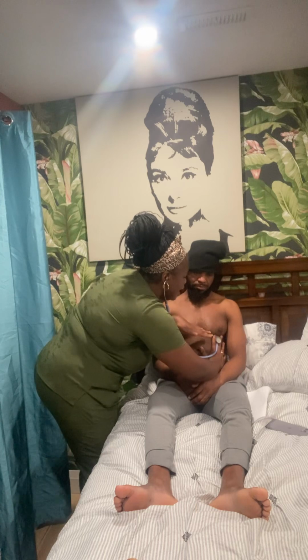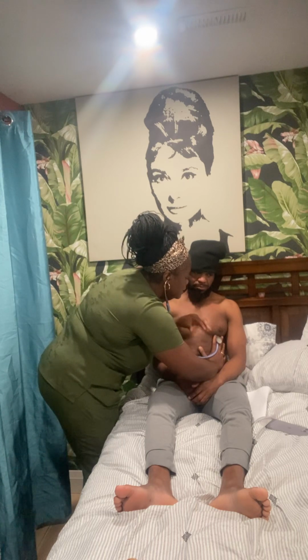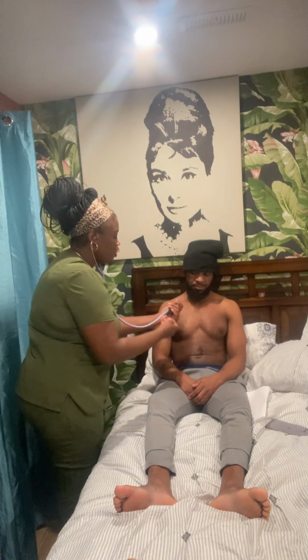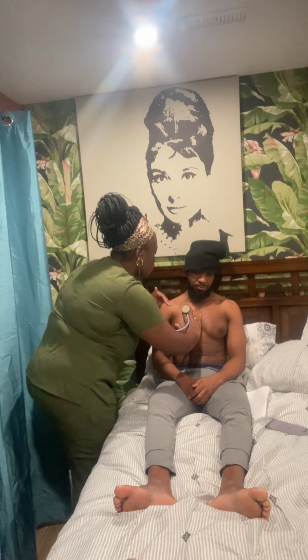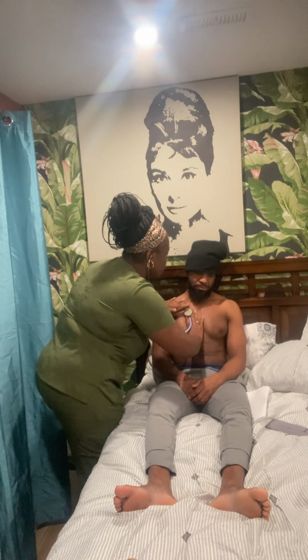Now at the mitral valve, I'm going to be auscultating for the apical pulse. This is where you get the most accurate reading for a patient that has any form of irregular heart rate or murmurs. That's where you would check for a full minute. Now I'm going to be turning over the diaphragm. Now I'm going to be listening for murmurs. Now murmurs sound like a whooshing or swooshing sound. So we're going to go again, second intercostal space. So we're going to do the aortic.